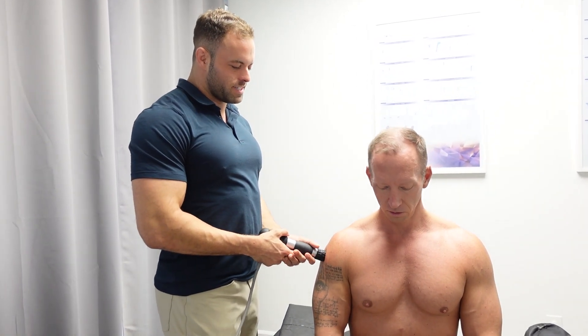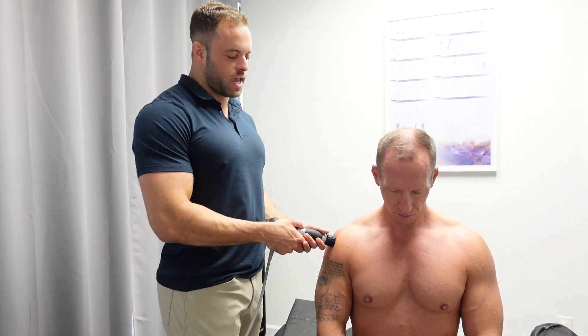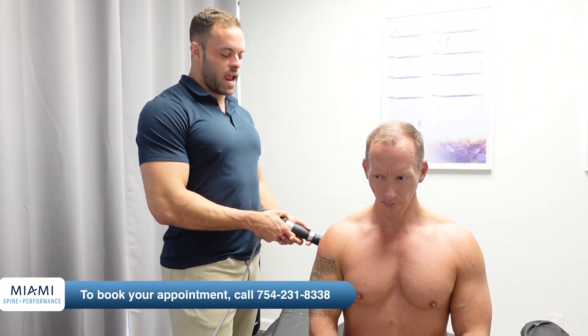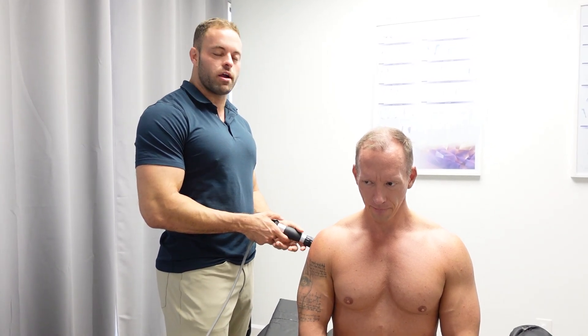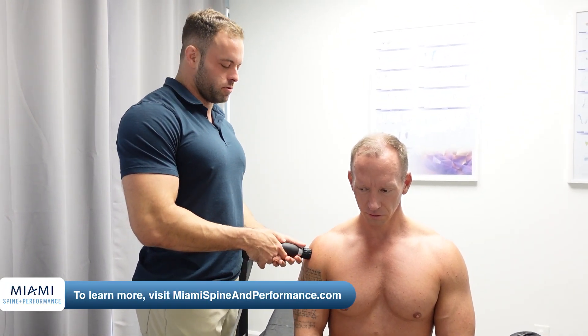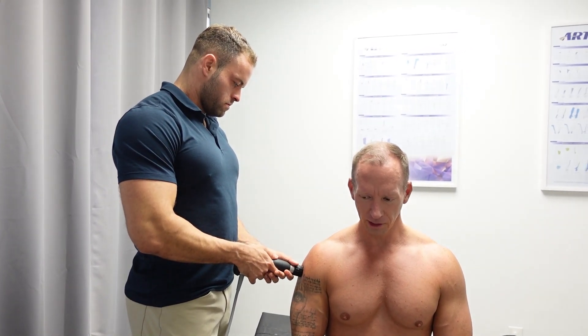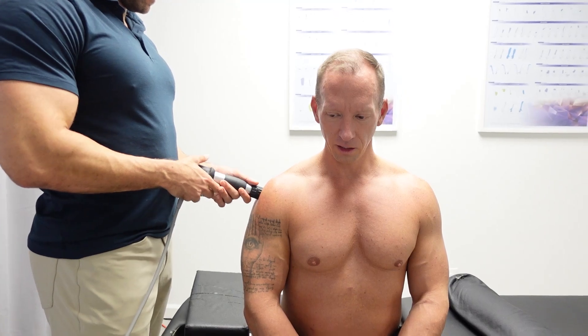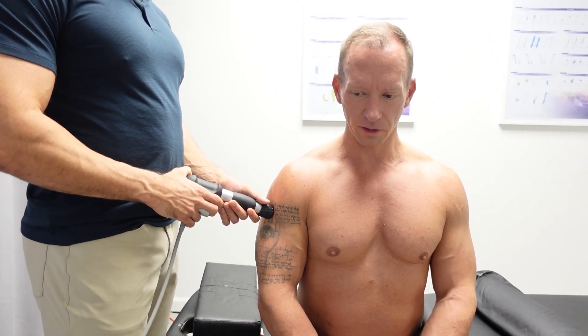This machine is great because it's diagnostic as well. Somebody can come in with shoulder pain or knee pain and I can scan the entire joint and find specifically the area where the damage is, so we can make sure that the treatment is as focused as possible. I would say right around the labral part of it and then the insertion of the lateral deltoid into the humerus.